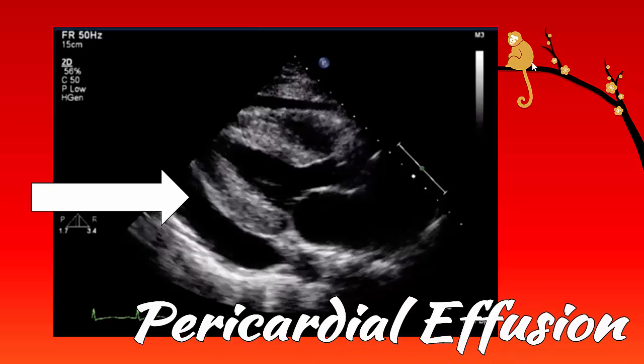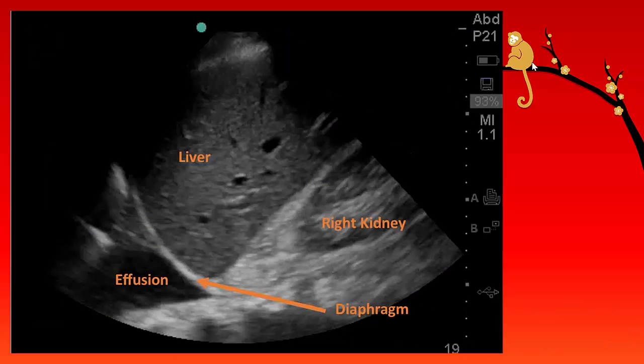Next, you have your pericardial view, and you can see there's a large dark stripe around that part, suggesting free fluid in the pericardium, which is always going to be pathologic in the setting of trauma. And again, this is someone you're going to need to call the trauma surgeon for.